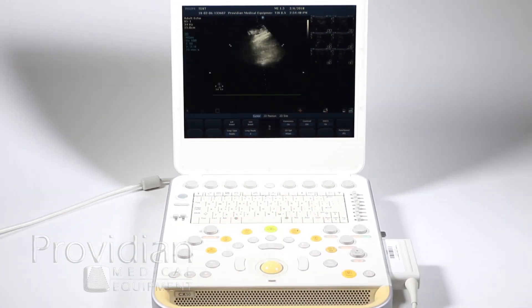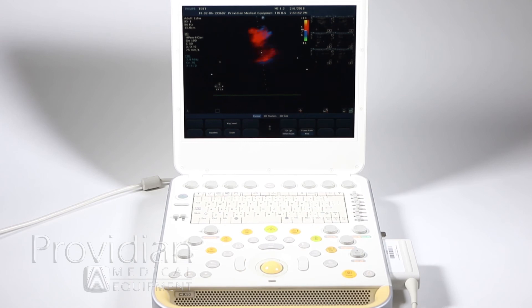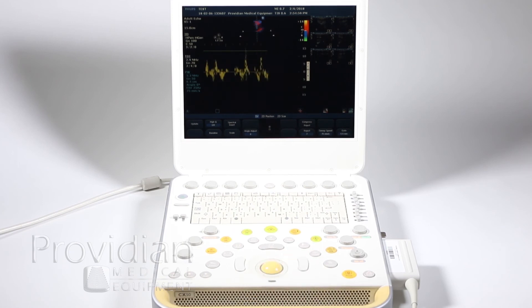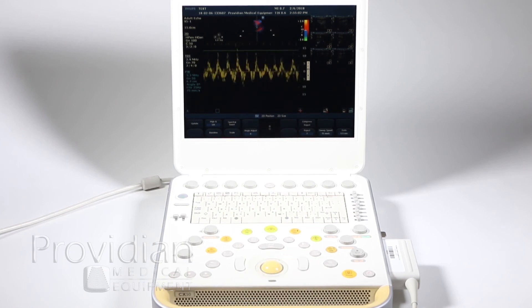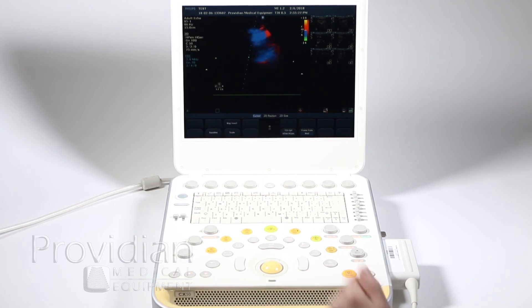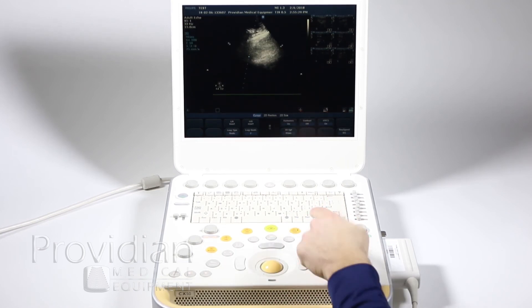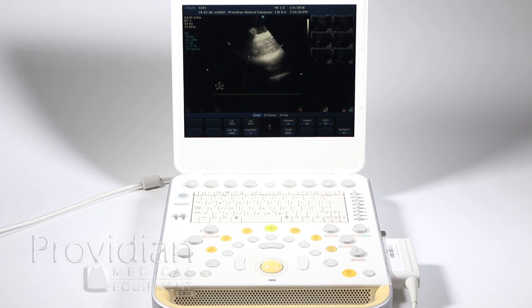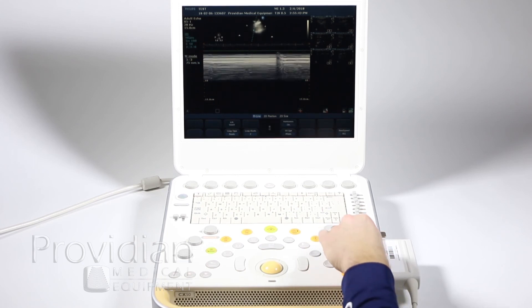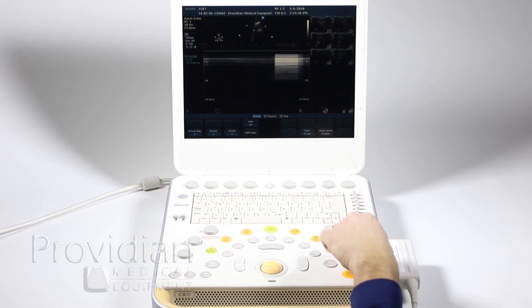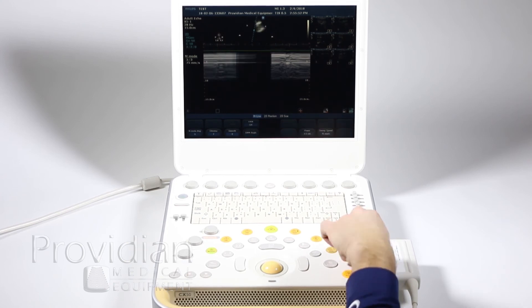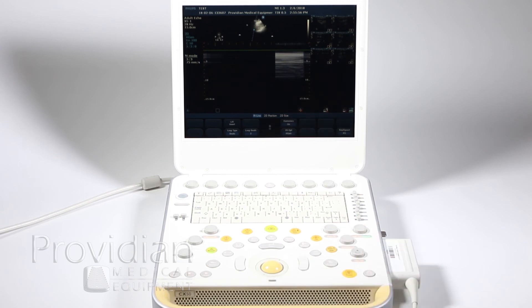Let's hit the 2D button and go over to Tissue Doppler. That's our Tissue Doppler Imaging. You can add PW Doppler by hitting PW. You can hit M mode — press M mode just to switch between TDI and M mode, flip back and forth. Notice it went to amber — green on, amber off as discussed earlier. This active gain allows you to change the gain in either image; just clicking active mode changes the gain in whichever image it's referring to.